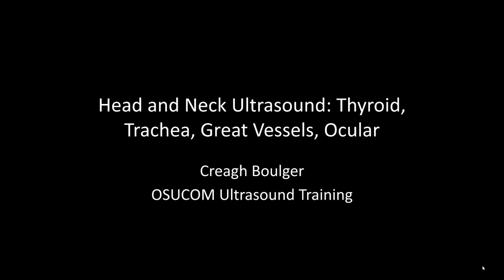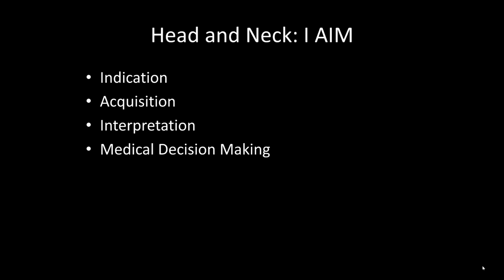My name is Cray Bolger, one of the ultrasound faculty at Ohio State University. Today we will be discussing head and neck ultrasound. As with any exam, we will review indications, acquisition, interpretation, and medical decision-making.